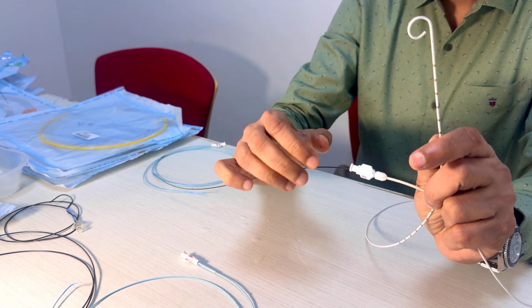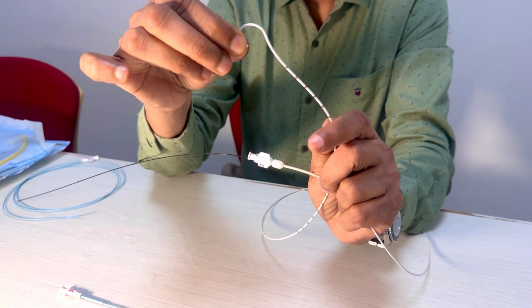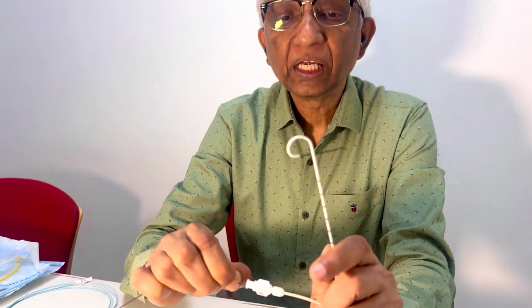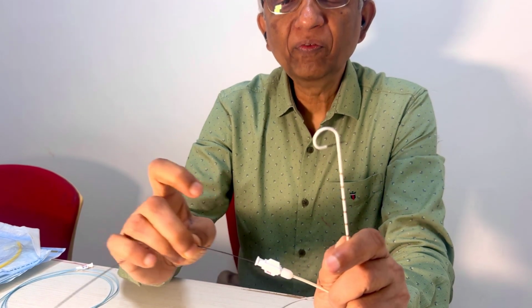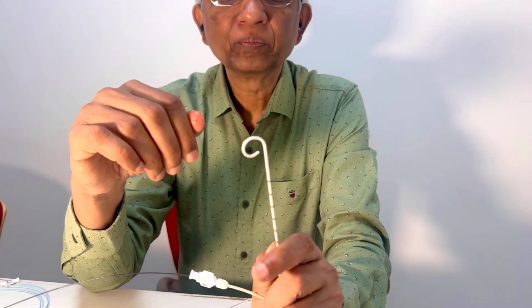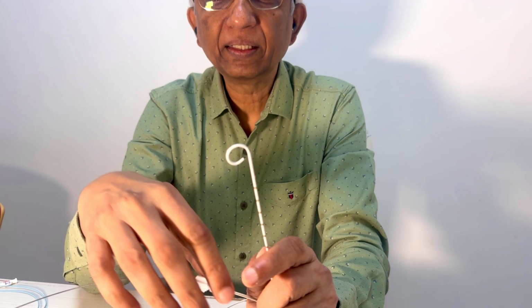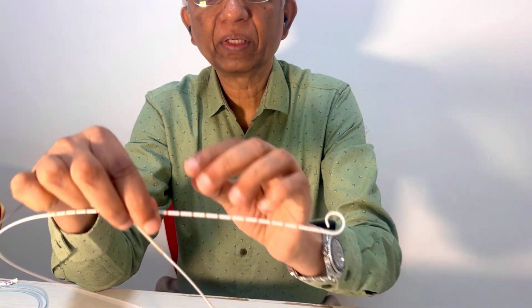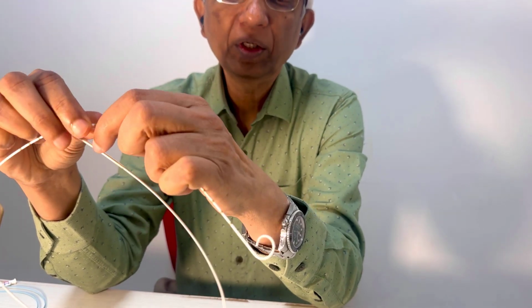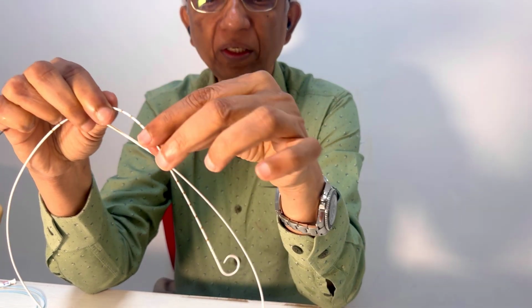Now, for example, if you bring this across the bifurcation, it actually takes almost a tight angle like this, and you can actually try to cross it. Even more useful than that, look at that, it just opens at this point. Now, even more useful than that is when you come transradial or transbrachial, and we want to enter the descending aorta. It gives you a very, very good angle. For example, I'm coming from the arm. Typically when you come from the arm, the catheter will go straight into the ascending aorta.